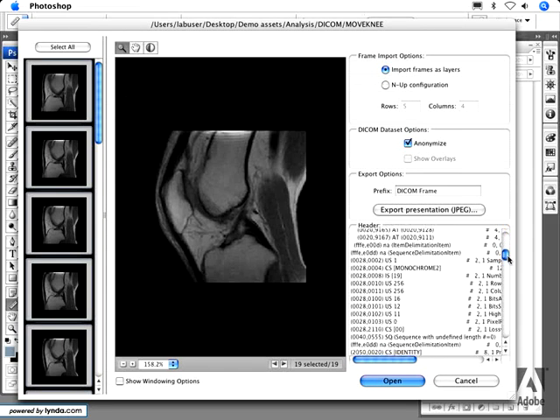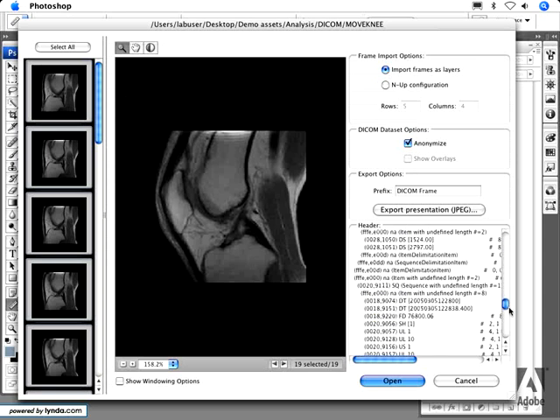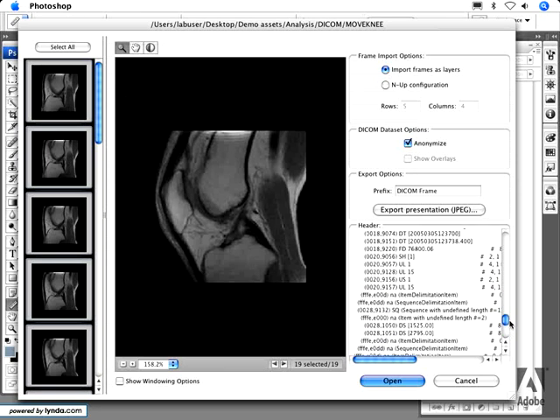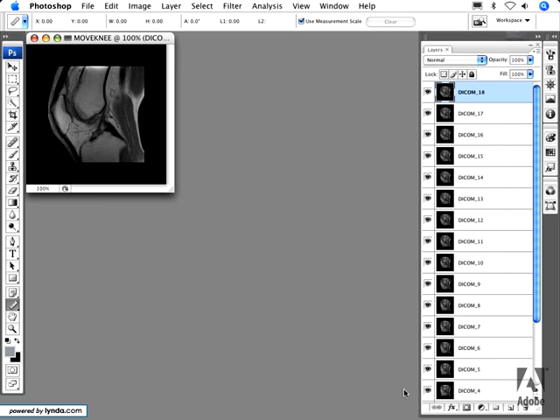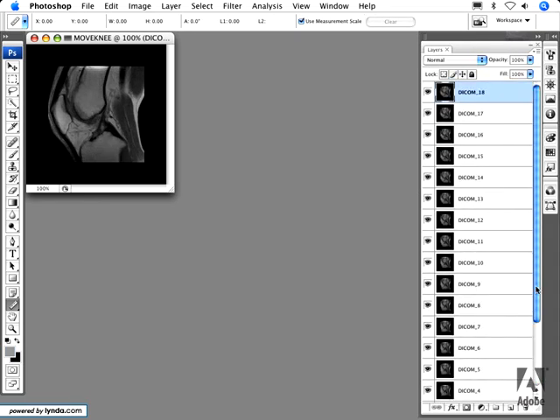You can also look through all of the header information before opening any of the frames into Photoshop. In this example, I'm going to import each individual frame as a layer and anonymize the data as well. When I press Open, you can see each of the DICOM frames is imported as an individual Photoshop layer.